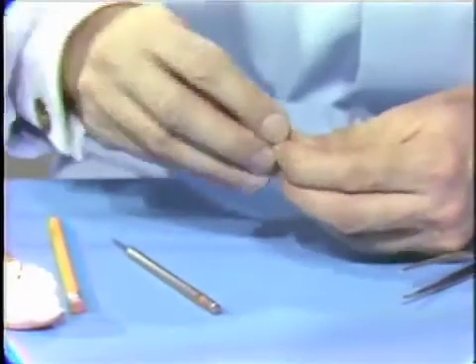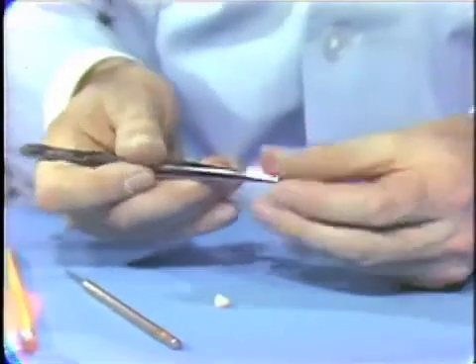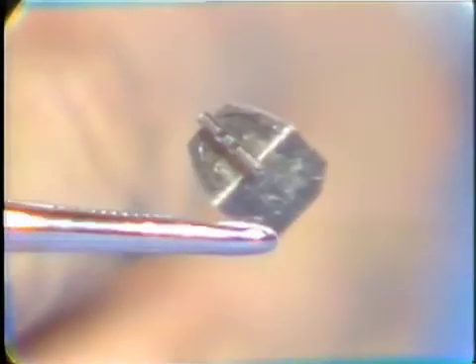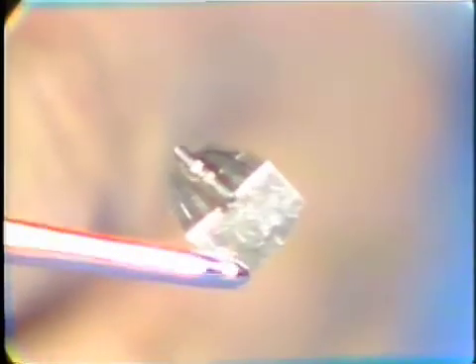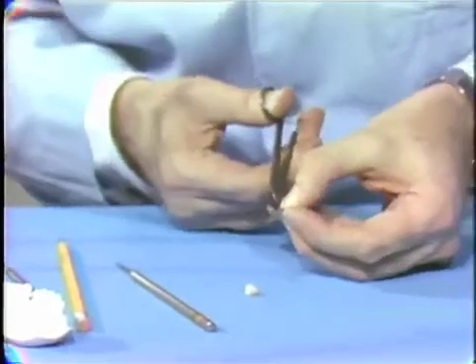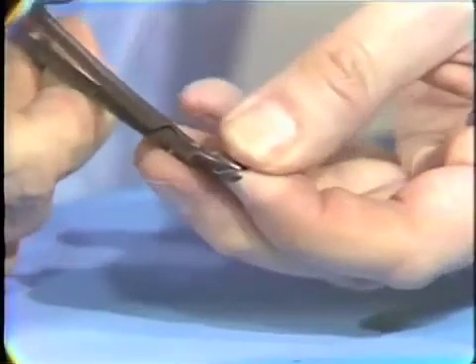Now, I'll slide the backing off, and we'll see if in a close-up you can identify the scratch marks on it. I'm not sure how well they may show in this situation. Let's just see if I can get the light off it. I think you can see on one part of it there the indication of the boundary, and I think perhaps you can just see it a little there. That gives us a fairly clear definition of where we're going to cut. So now we take our crown shears, and you won't be able to follow this too closely, I don't think. We proceed to cut the gold back to those boundaries.